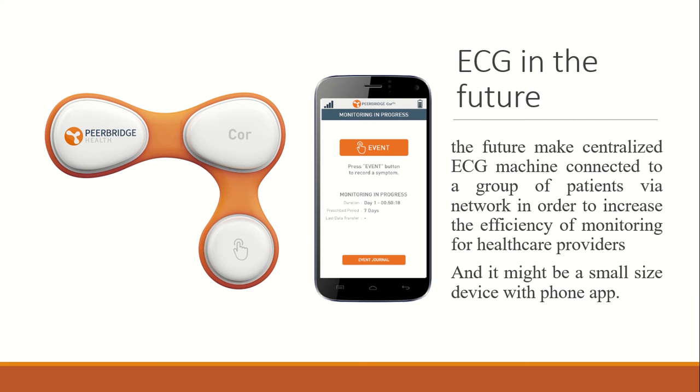And here, this is the future one. In the future, it might be a centralized ECG machine connected to a group of patients via network in order to increase the efficiency of monitoring by the healthcare providers. And the last one, it might be a small device with a phone app.